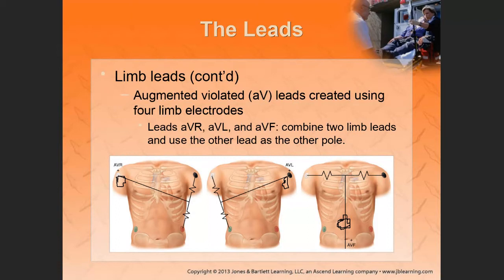Which lead would be the ground lead, the one that stabilizes the current? Agreed. Good. Right? And they are labeled. So you have RA, LA, RL, LL. Know what that represents, but anyway, that's the easy part.